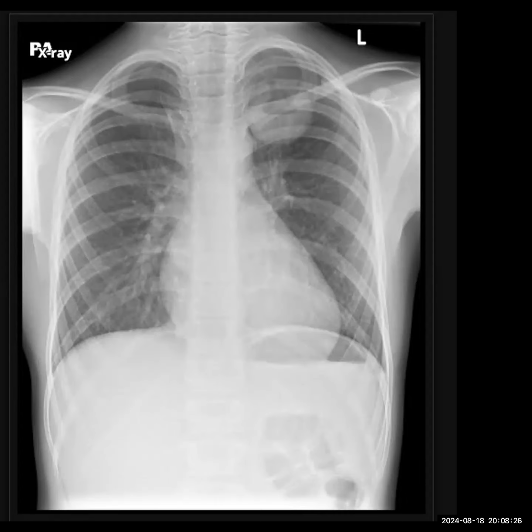If I were to say it's metastasis, what are your differentials? A single metastasis into the lung, I would be thinking of a colon primary. You're talking about a cavitating lung metastasis, is it? Yes, if it's a cavitating lung metastasis, I would think of a squamous cell primary, from the head and neck. For female patients, I would think of a cervical malignancy. They could give rise to cavitating mets. Anything else?